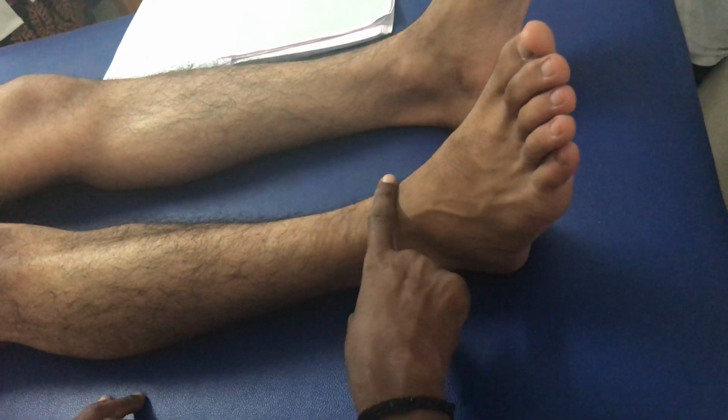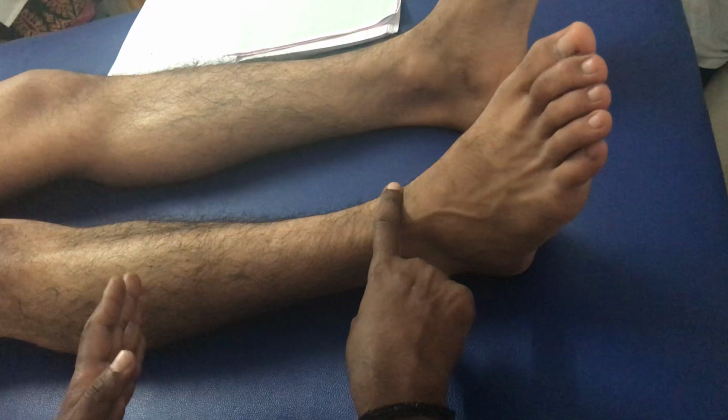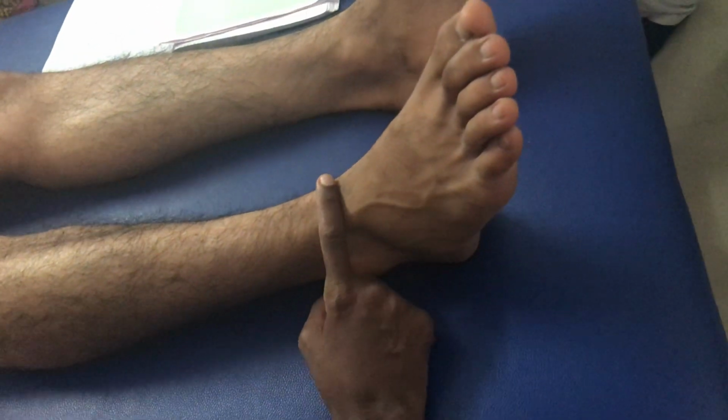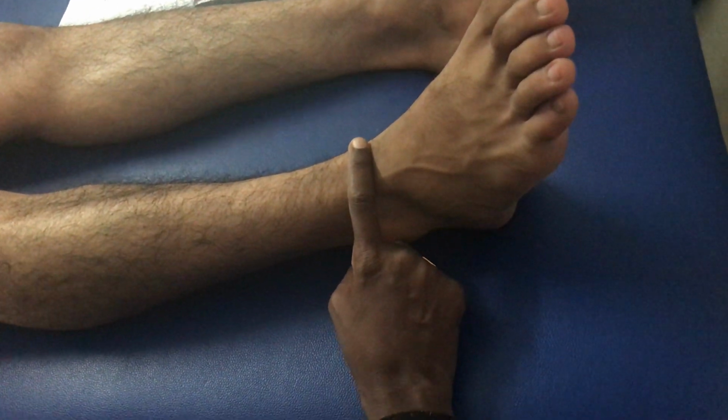You have to put your finger on the tibialis anterior and palpate until the end, so that you are getting the stimulation of tibialis anterior only. That's what, it's a minimum palpable contraction that we are looking for.